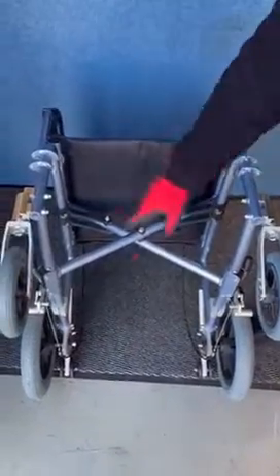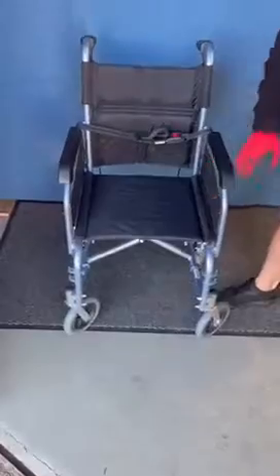Once the chair is lined up, as you can see here, this side of the rivets, the chair can come back to normal, back up by it, and you can use the chair.